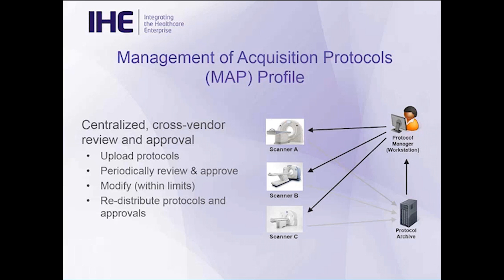And then finally, once they've been approved and edited appropriately, those can be redistributed out to the different scanners. So decide which protocols you want running on which scanners, which ones are approved. That information gets pushed out.